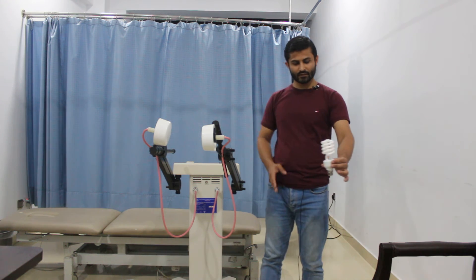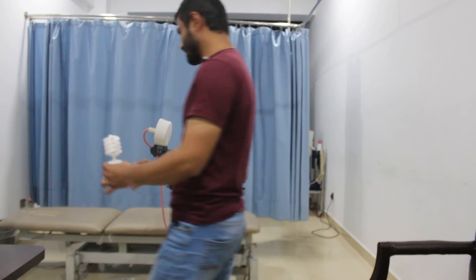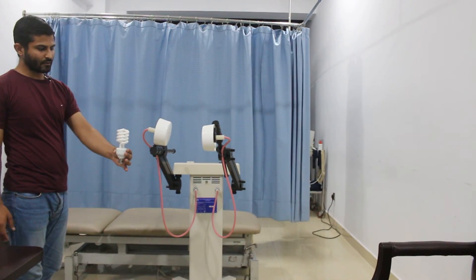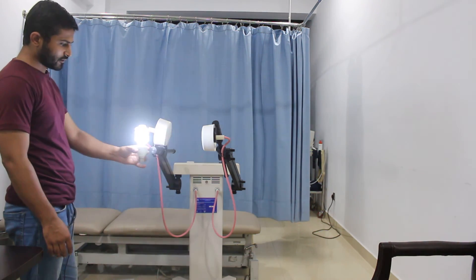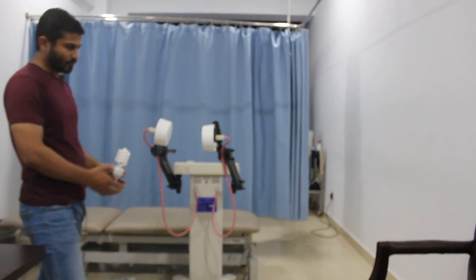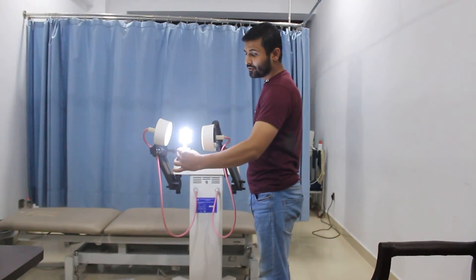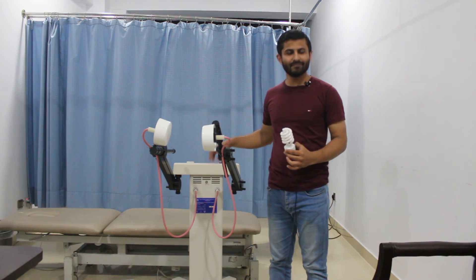We can also assess the safe distance around this unit. As soon as I bring the bulb close to the machine, you can see it starts glowing. The electromagnetic field is all around, but this is the point where it is most focused. That's how you can assess or check the output of a shortwave diathermy machine. Thank you very much.